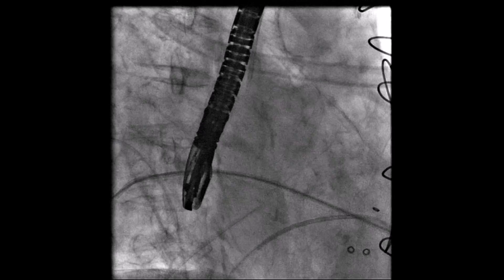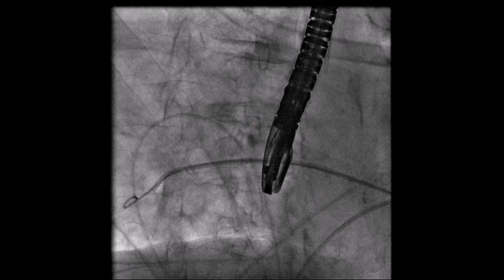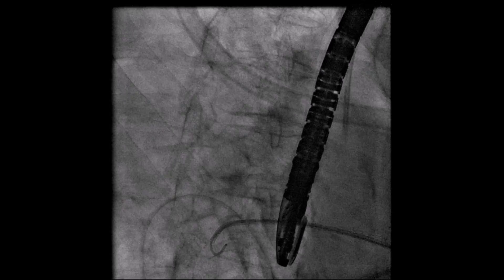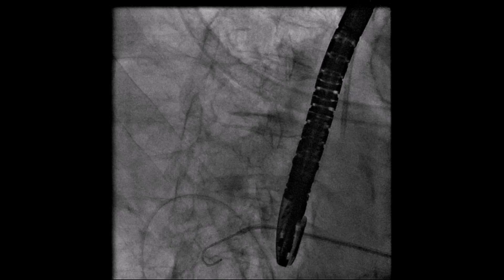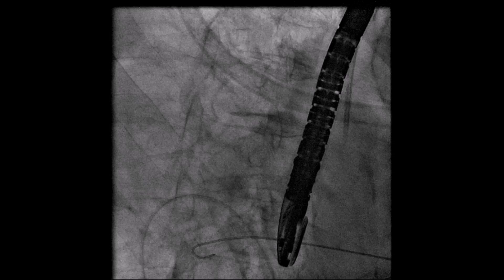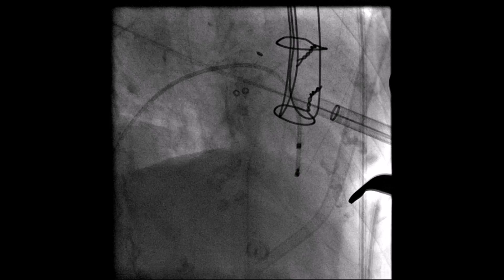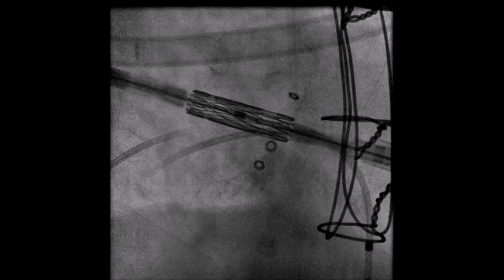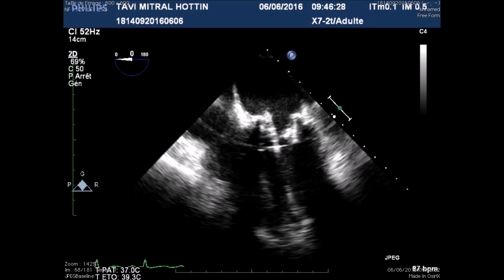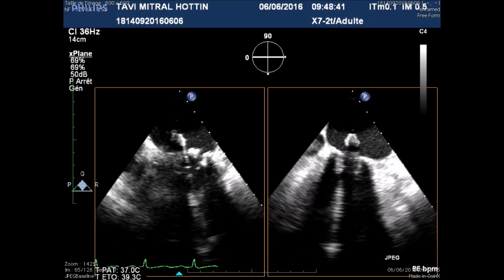The wire was placed at the level of the right superior pulmonary vein and then changed for an extra stiff wire through a right Judkins catheter. Then the apical sheath introducer was placed as usual. It is important to notice that for the mosaic valve, the annular plane is not seen on fluoroscopy, and transesophageal guidance is of utmost importance.